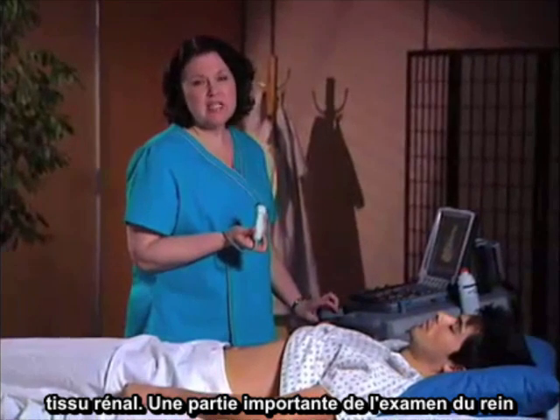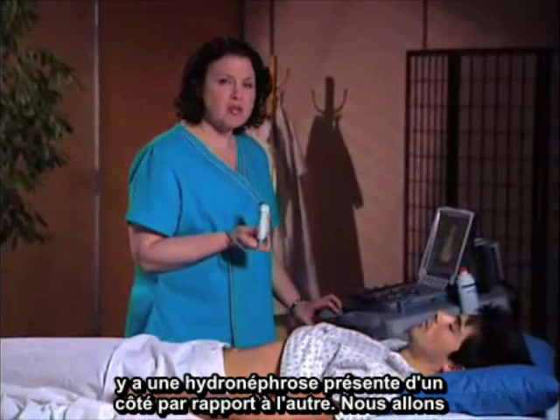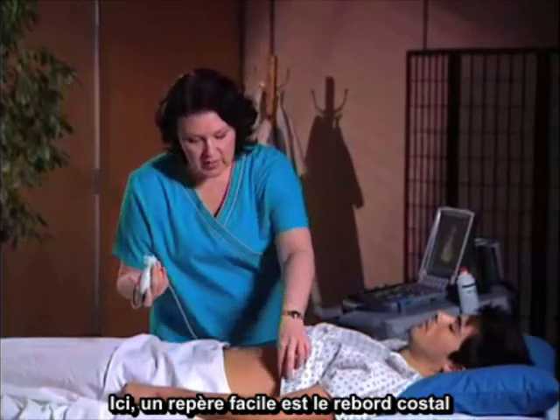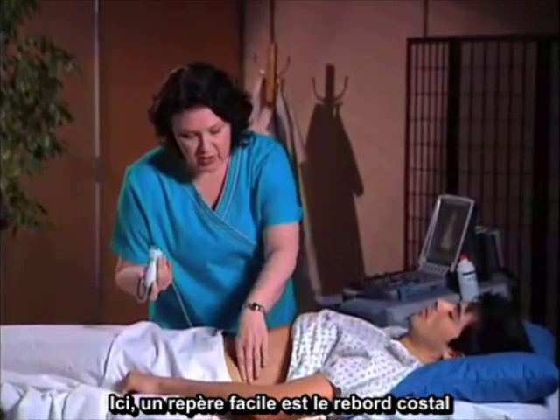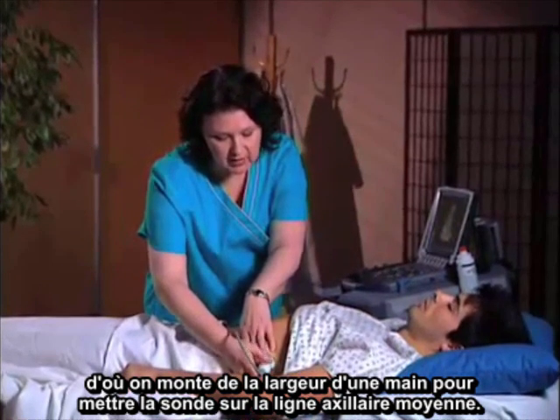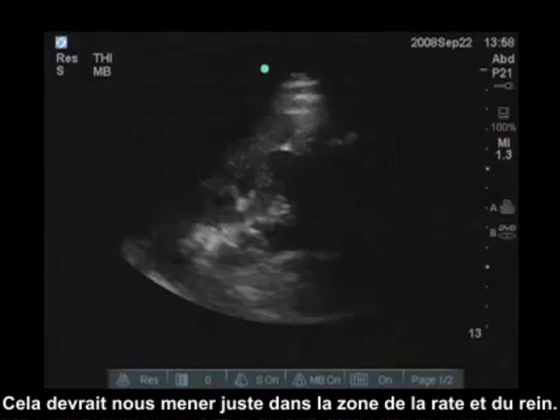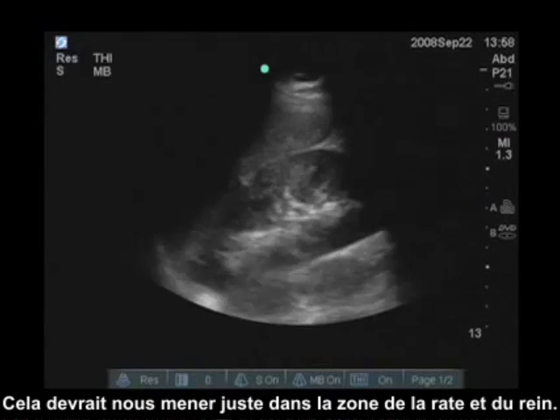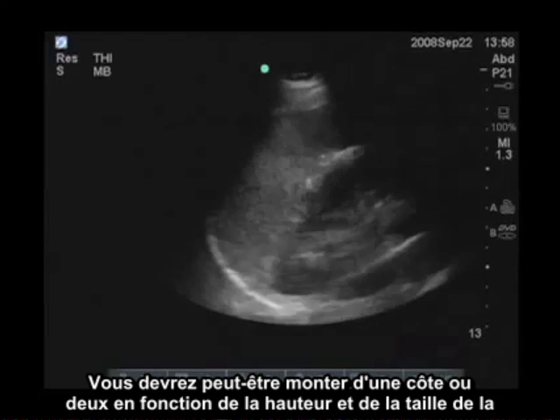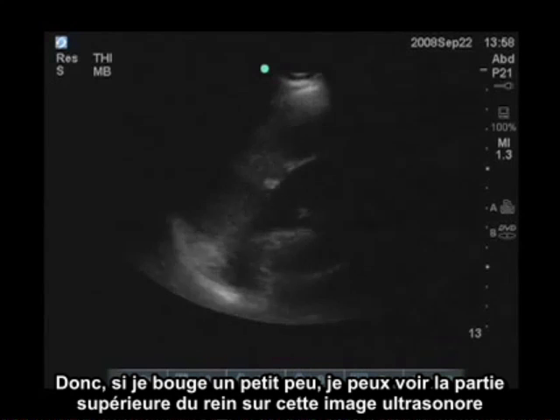An important part of a kidney evaluation is a bilateral comparison between the right and left kidney to determine if there's hydronephrosis present on one side versus the other. So we'll go ahead and do the left side as well. An easy landmark here is just to identify the costal margin and then move up one hand's width and bring your transducer in at the mid-axillary line. This should get us right in the area of the spleen and the kidney. You may need to move up a rib space or two to determine how high and how small the spleen is, because you're using the spleen as your window to evaluate the kidney.